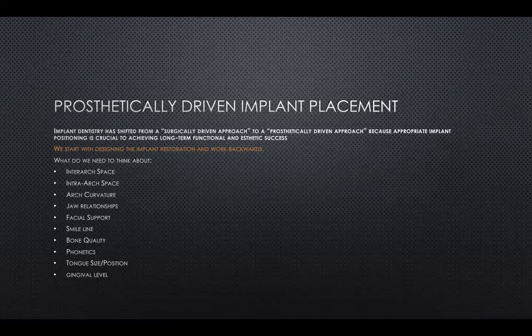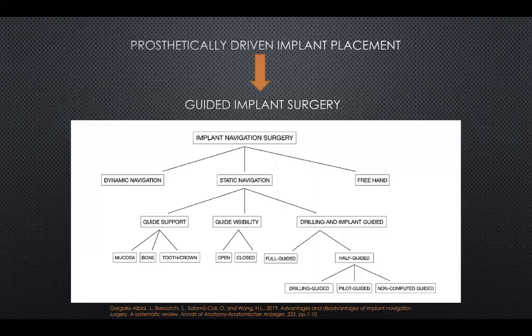So there are a lot of factors to be considered, and it depends on the type of restoration that you're planning, whether it's a single implant, or an implant supported fixed partial denture, or a full implant supported complete denture. This concept of prosthetically driven implant placement has led us to the need for guided implant surgery. So we need to have guides that guide our implant placement where we need it to be.